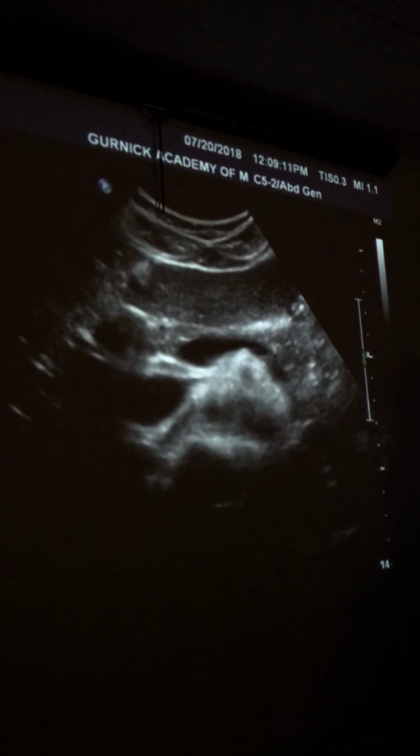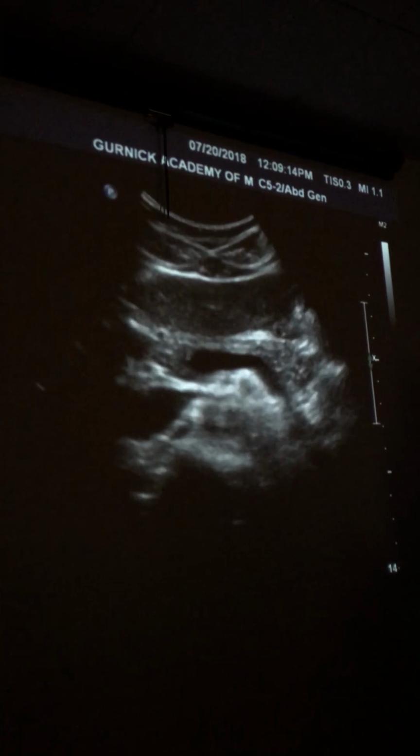Questions, guys? Does that make sense? Yes. So what anatomy am I seeing here?